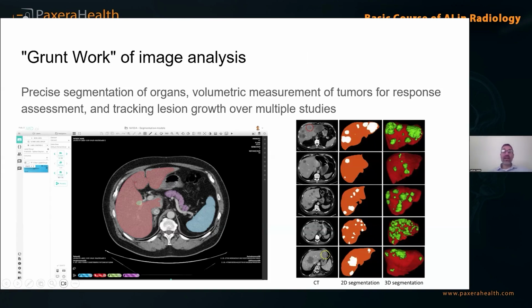And how do we attest, for instance, if patients are getting chemotherapy or radiation therapy? Or how can we tell that there's resolution or there is progression of disease? And this is where, look at this area of segmentation, where we can actually get volumetric measurements. Instead of these rudimentary measurements like the length of a liver, we can actually give actual volume. Or we'll have new nomograms, volumetric nomograms, instead of the length of the spleen. Or, for example, pancreatic or even vessel volumetric segmentation.